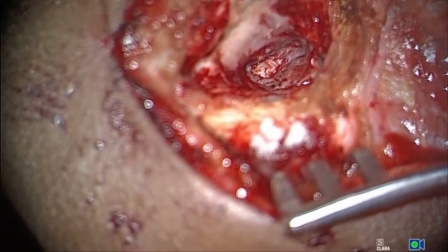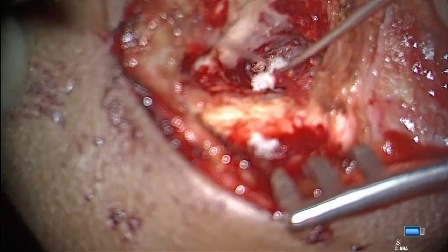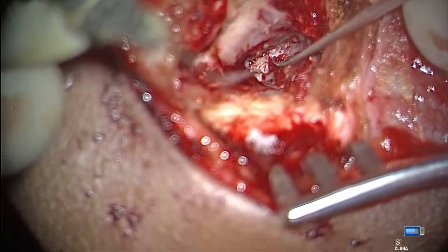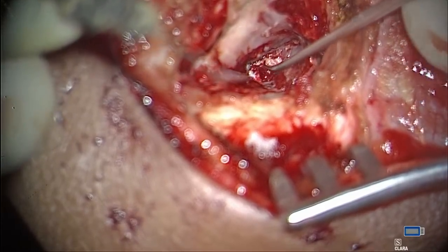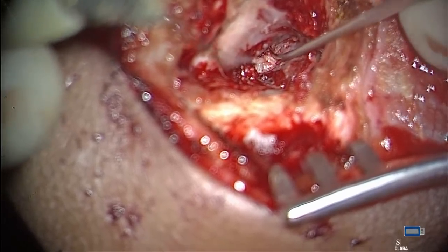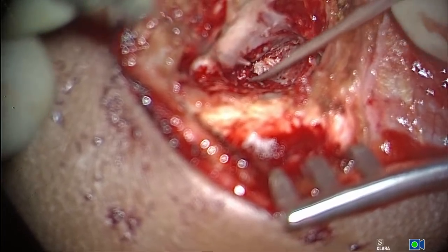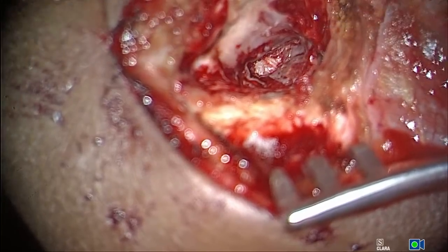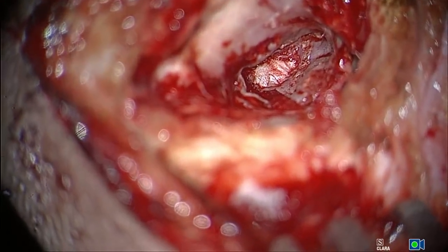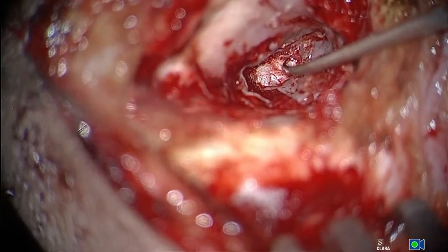Now see that? How beautiful the graft looks. This is very important. I'm trying now to iron out the graft. I'll just roll it over the graft. So then I have a very clean layer of graft over which the flap will grow. The flap is just going over that perforation. That's it. Can you all appreciate that? All the edges are completely approximated. I call that the suture line. This is called the suture line between the graft and the flap.